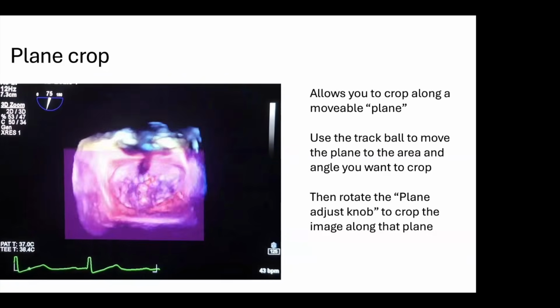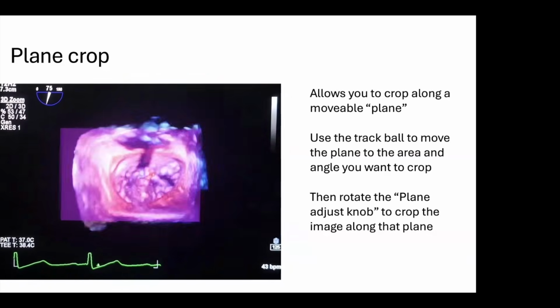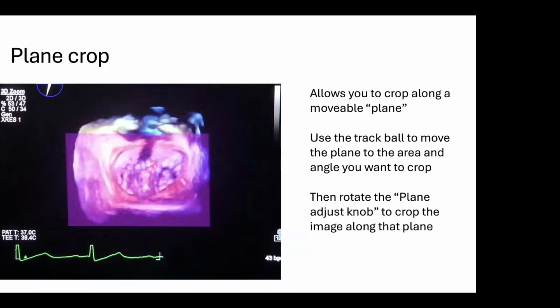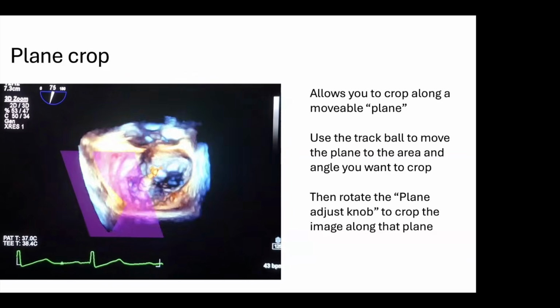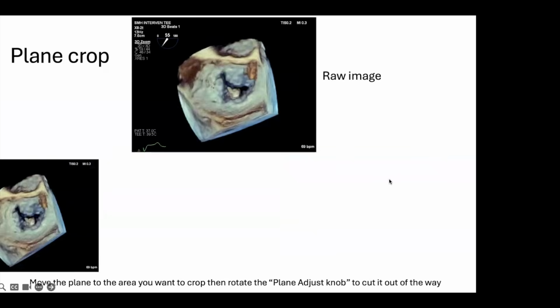And so the handy thing of this plane crop is that it gives you a lot of control in terms of what you want to crop out in any plane that you want in 3D space. But as a result, there's more input that you need to put in. I find it's often not necessary, but it gives you good control. So if you wanted to have more control, maybe plane crop is for you.